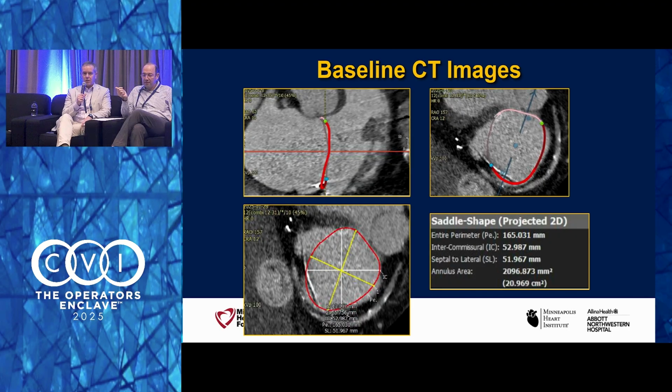And if they meet criteria, then I think it's reasonable. If there's severe RV dysfunction, then you're having a different discussion. So whatever you can do to figure out the full context of the RV. The relative EF is going to be exceedingly low on this, but the annular motion wasn't awful. I think it's a good discussion: would this person survive, and how to help them through that with prehab and then post-hab of the RV.